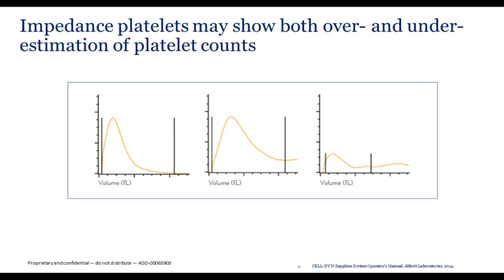The resulting impedance histogram shows three scenarios. A normal platelet count appears on the far left. In the middle, an overlap region on the right-hand side of the histogram most likely indicates macrocytic thrombocytes. The histogram on the far right indicates a mixed population of red cell fragments or large platelets. The two abnormal histograms on the right indicate a problem with the platelet count, and the result will most likely be flagged and require confirmation by alternate technology.